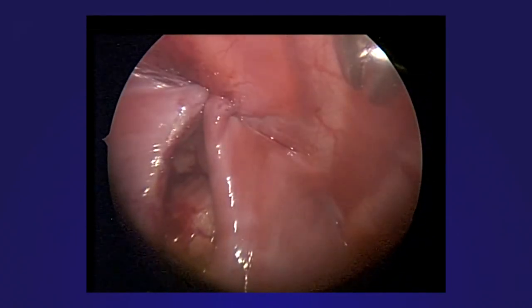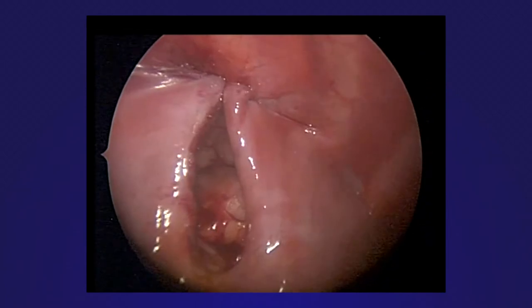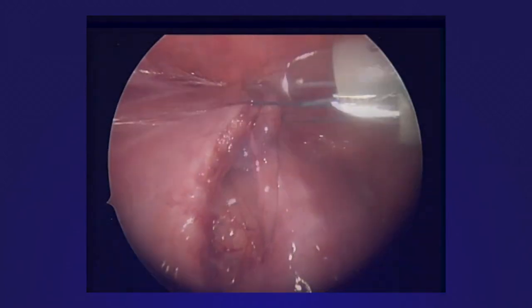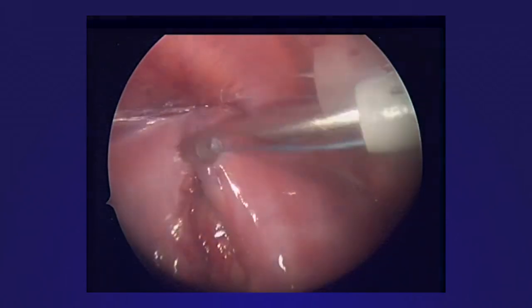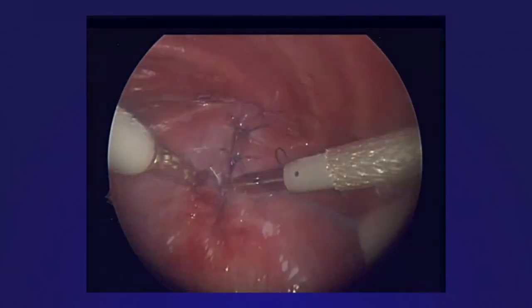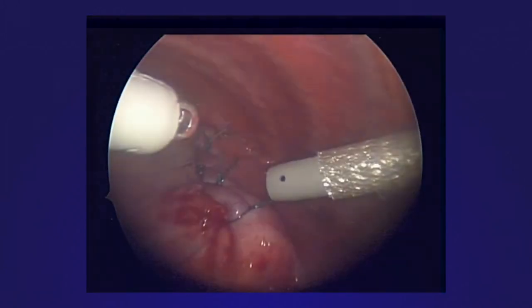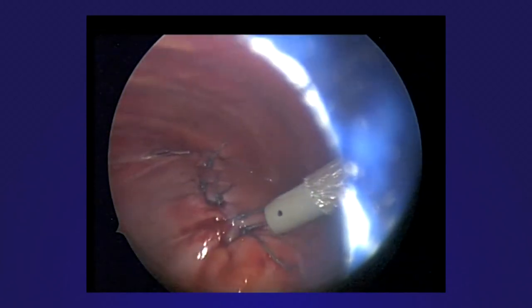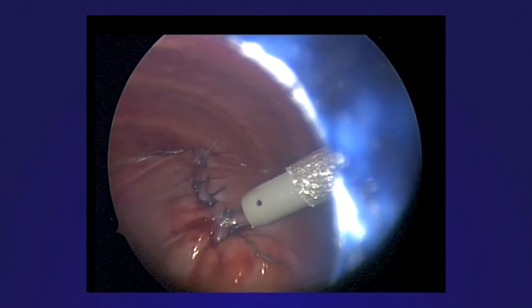One can see that completion of this stitch nicely outlines the remainder of the defect. Additional interrupted 2-O Ethibond sutures are then placed to approximate the defect and tied extracorporeally. The most medial suture is placed, followed by a final suture in a small gap in the medial aspect.